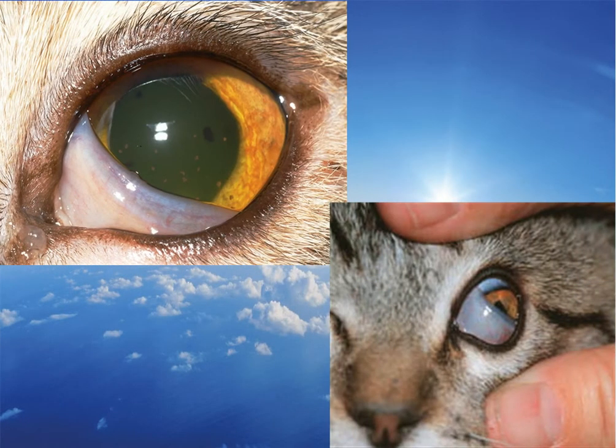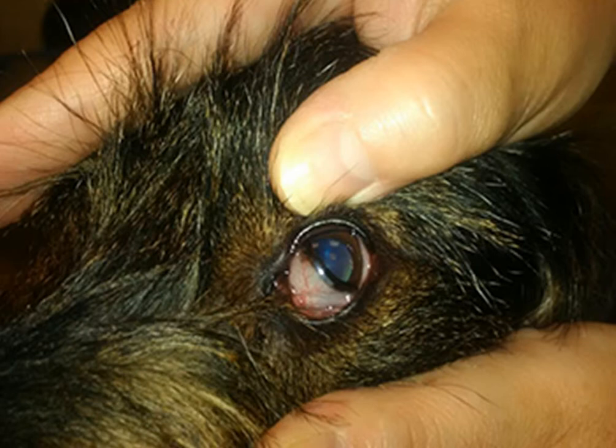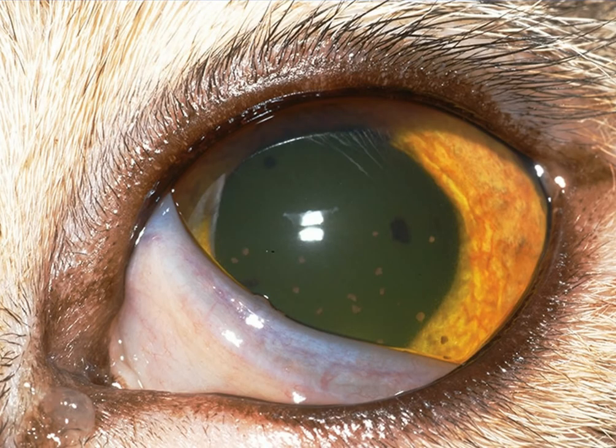The third eyelid is a fold of mucous membrane located at the medial canthus. It moves laterally when the eye sinks under the effect of pulling by the retractor bulbi muscle behind the eye. This nictitating membrane is strong, wet, and its inner surface is rich in lymphocytes — immune cells. Accordingly, it can be used to support the cornea during the active phase of the corneal ulcer.